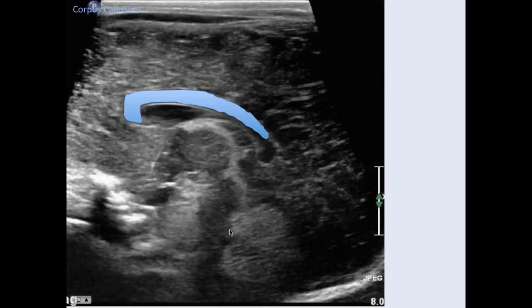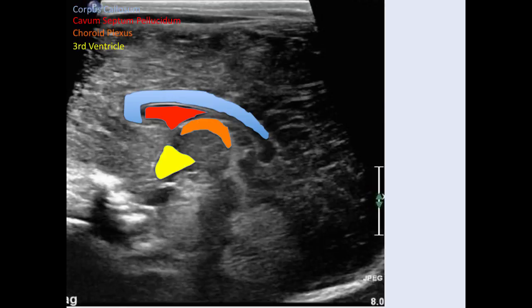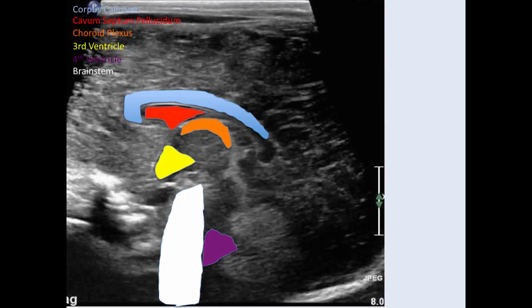Another important structure to assess is the cavum septum pellucidum. This is the choroid plexus within the roof of the third ventricle. The third ventricle is here, the fourth ventricle is down there, and the brain stem. The other important structure in the midline to assess is the vermis of the cerebellum, which can also be absent in some conditions like Dandy-Walker malformations and other conditions.